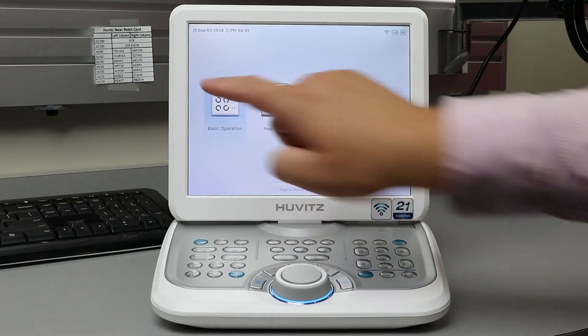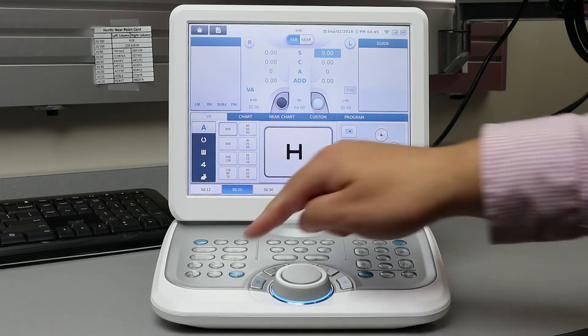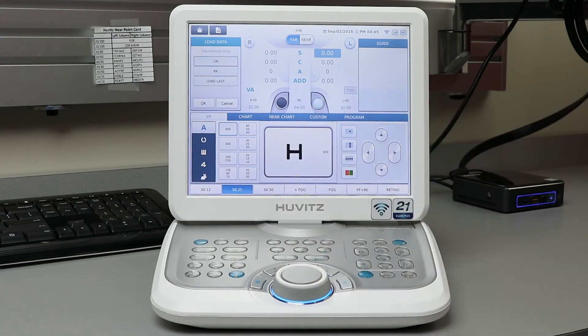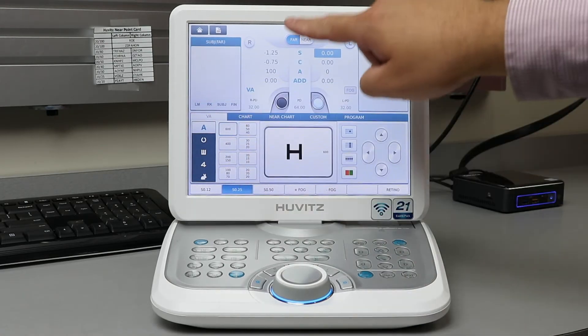Now go to basic operation. This is where you will do a majority of the testing. To start, press the load button on the keypad, then select Auto Lens Meter, Auto Refractor Keratometer, and which patient you would like to begin with. Their information will be displayed here.